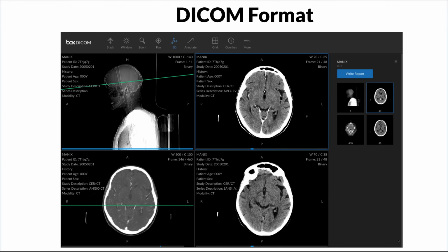All right, so we have: it deals with the storage of digital files. Digital imaging and communication in medicine that allows transferring, processing, and storage of information like CT. That's Anthony. Standard use in sharing. Then it's basically about images. All right, so most of what you said is correct. So let's dig deeper and find out a lot about this DICOM, like somebody gave the full definition.